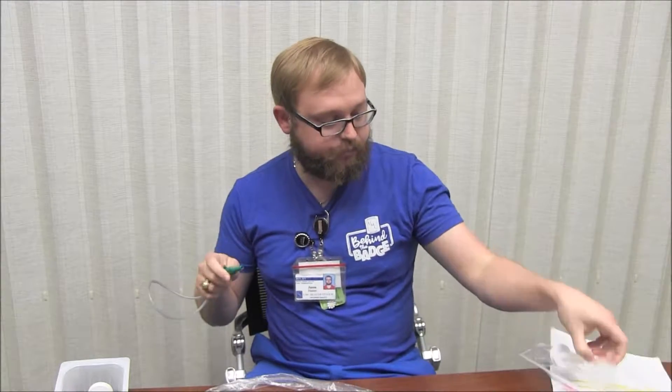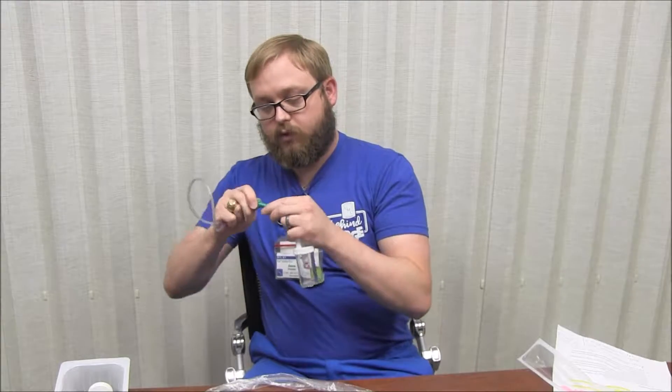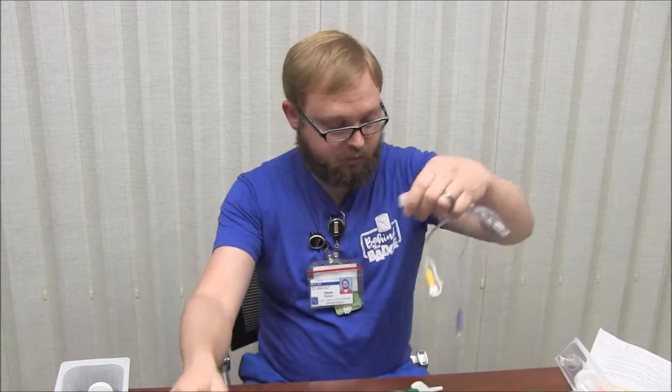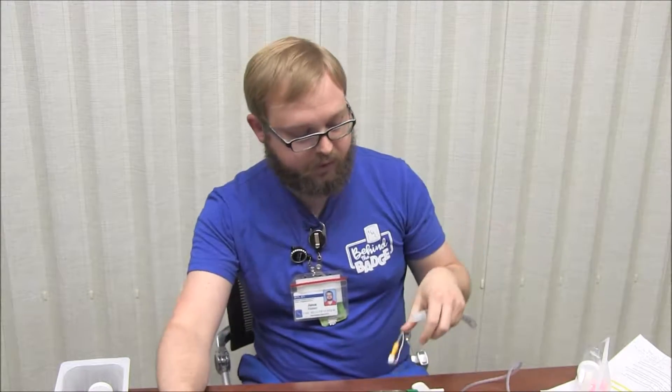We don't want you to set the lucans tube on the bedside table or the bed — just leave it in the cradle. While you're sterile, you'll go ahead and hook up. You'll also need your buddy to connect your 10-foot long tubing to the other end. Your buddy is going to be the one that disconnects the patient from the ventilator while you obtain your sample.